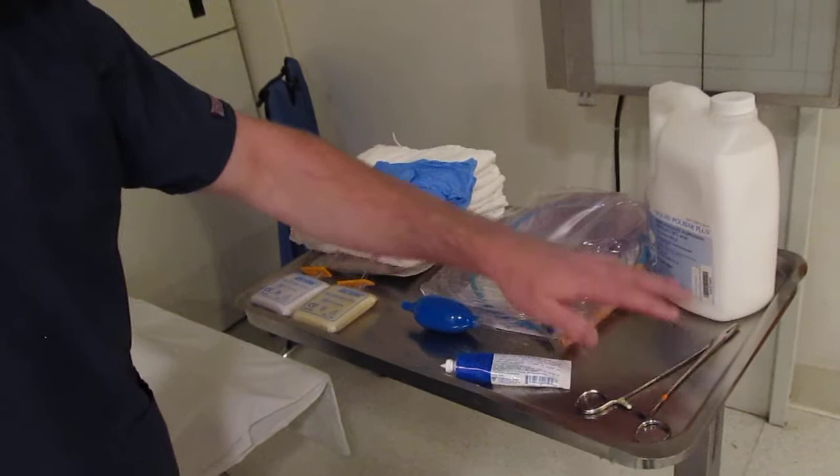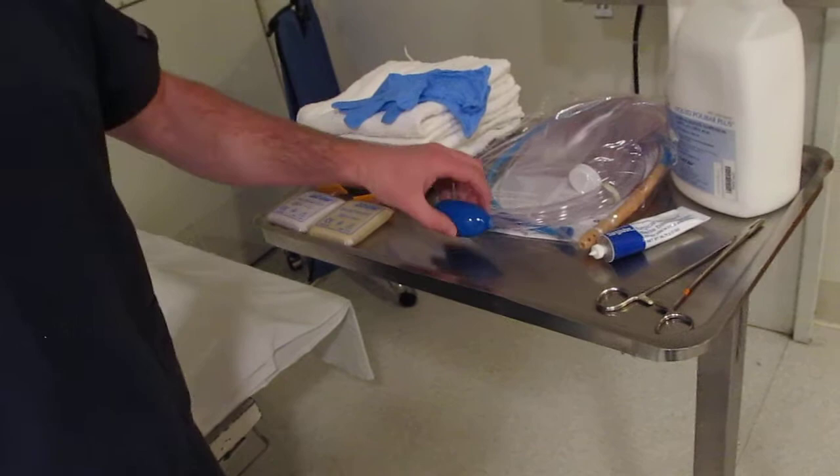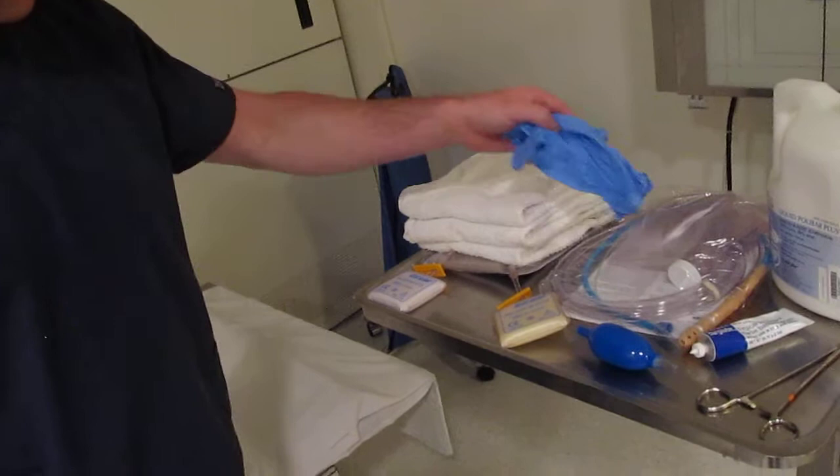We have our clamps right here which we'll clamp the tube with. We have our barium enema bag and tubing and the tip including our jelly, our KY lubricant. And here we have our air infuser and our balloon inflator. We also have some gloves and some chucks or some towels to sit down under the patient, and also the IV pole. And that's it for the supplies.